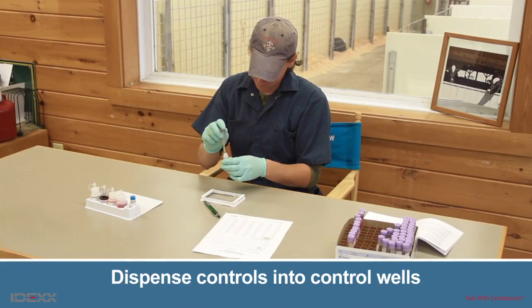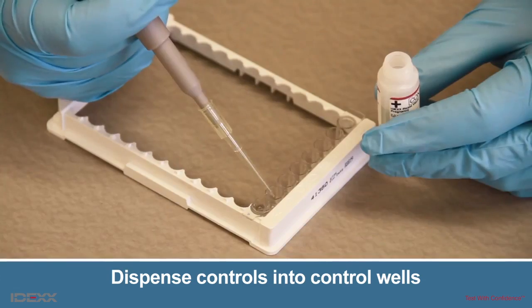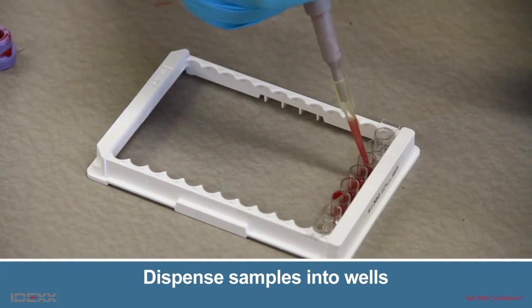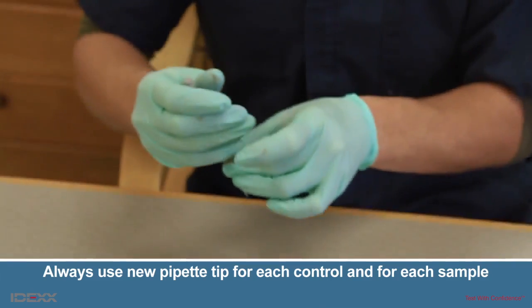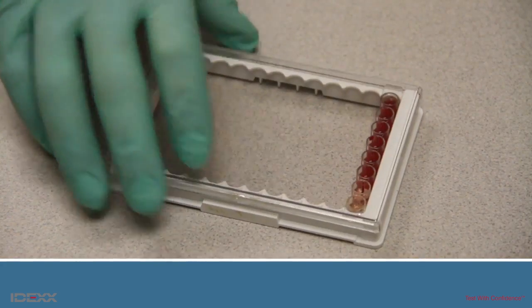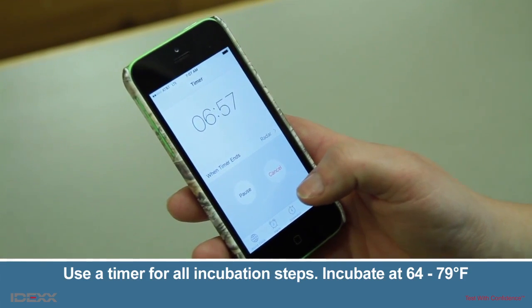Using the precision pipette, dispense 100 microliters of the negative control into the negative control well, and dispense 100 microliters of each sample into the appropriate wells. Make sure to always use a new pipette tip for controls and each sample. Dispense three drops of Reagent 1 into each well. Cover the wells with the plate cover and gently tap the plate 10 times to mix. Start the timer and incubate the plate for seven minutes at 64 to 79 degrees Fahrenheit.